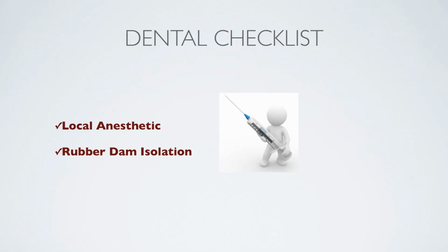Anesthesia is one of the most feared aspects of any dental procedure. Providing comfortable and profound anesthesia is the first step in starting off the root canal on the right foot. I make sure that I test each case after providing anesthesia with the application of endo ice on the tooth in question. If there's no thermal response, then I'm confident that we have achieved profound anesthesia and are ready to proceed.